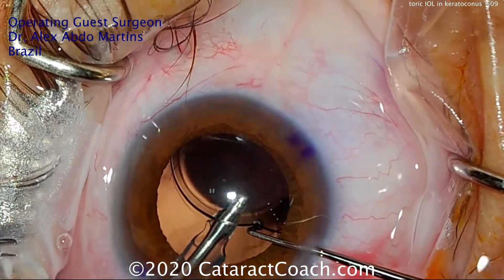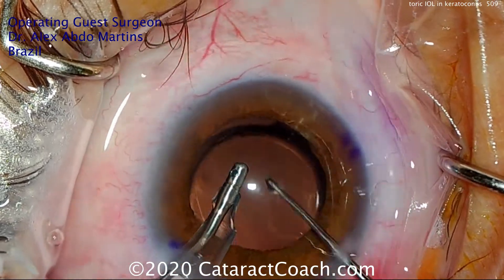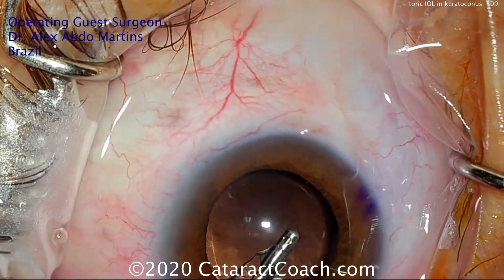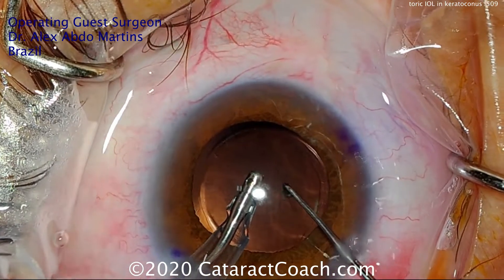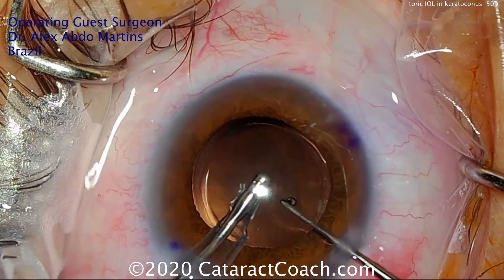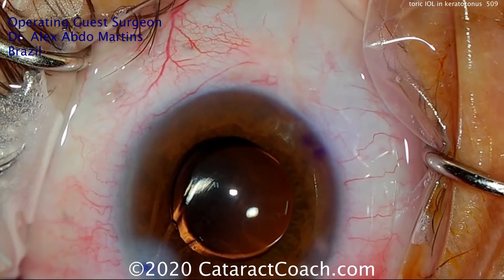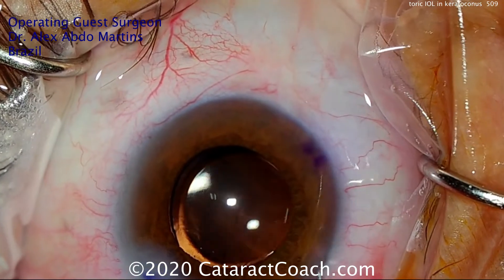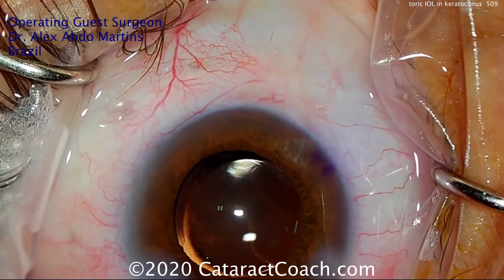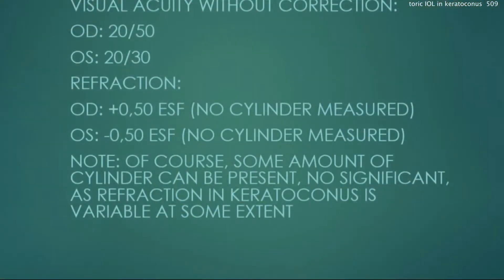Here's the end of the case. The IOL is in the capsular bag. It's very important to do this step — removing viscoelastic from behind the optic — so the optic can adhere nicely to the posterior capsule. Then rotate the lens to get it into the appropriate meridian and line it up with the steep axis.